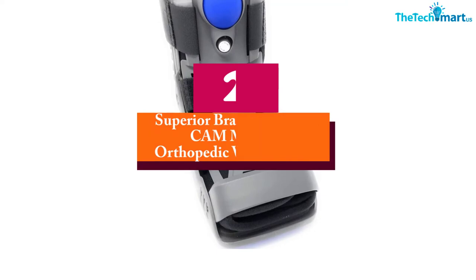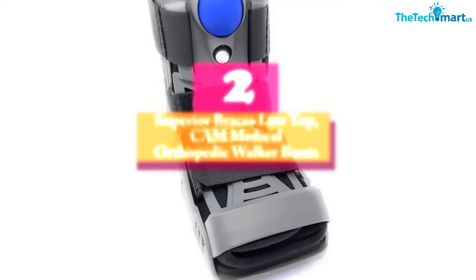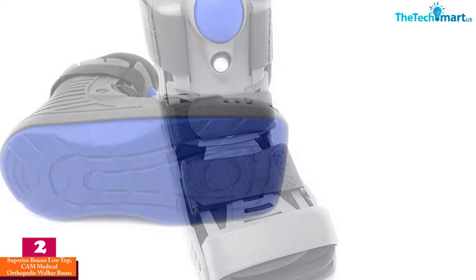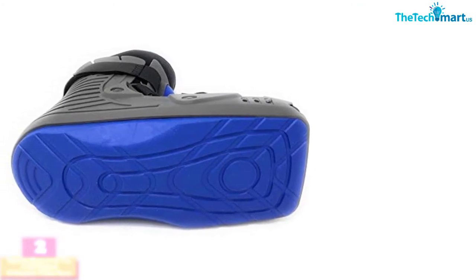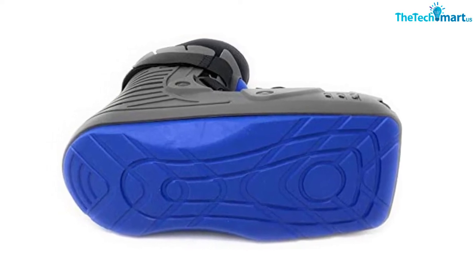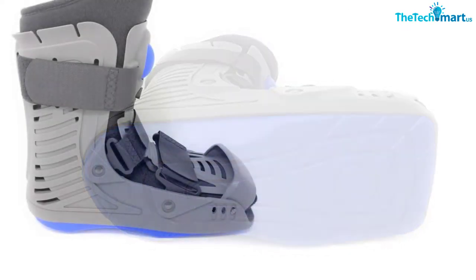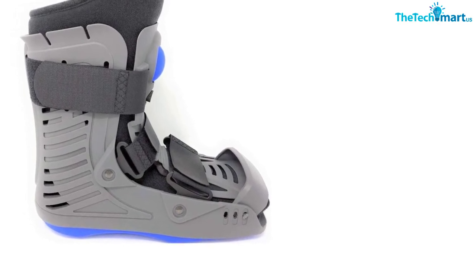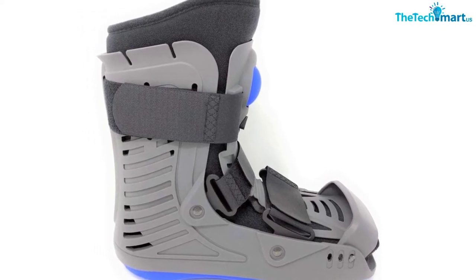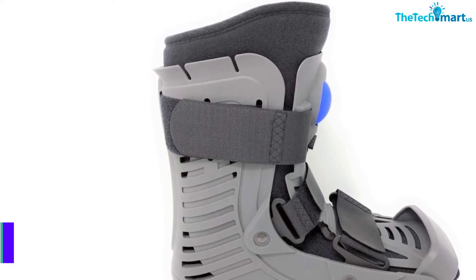At number 2, we have the Superior Braces Low Top Cam Medical Orthopedic Walker Boots. This medium-sized cam walker boot comes with a shock-absorbing insole, and the padded sole also helps you to reduce pressure on your foot and ankle. Moreover, the universal fit design offers a perfect fit for individuals, and you can wear this leg brace either on the left or on the right leg. The best-in-class ergonomic design helps you to walk comfortably for hours, and this fracture boot works efficiently to recover stable fractures.